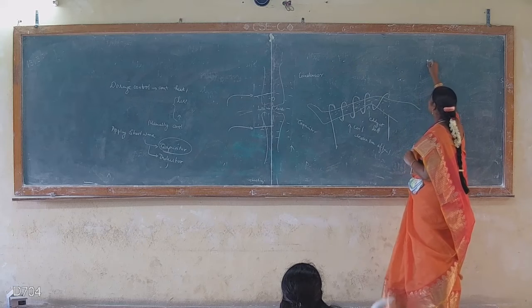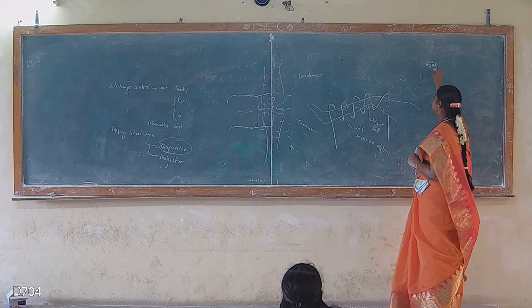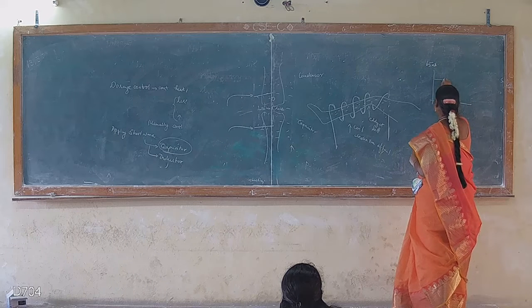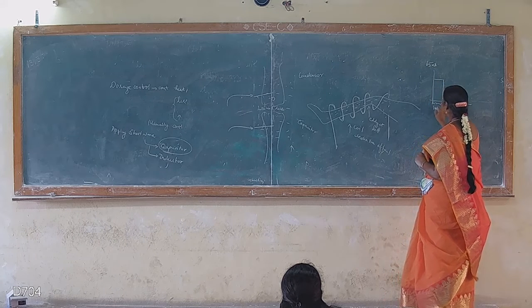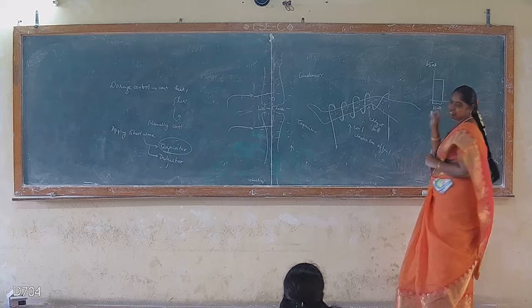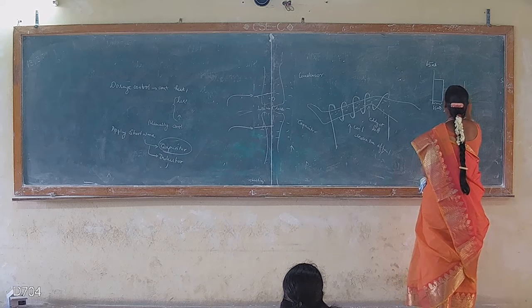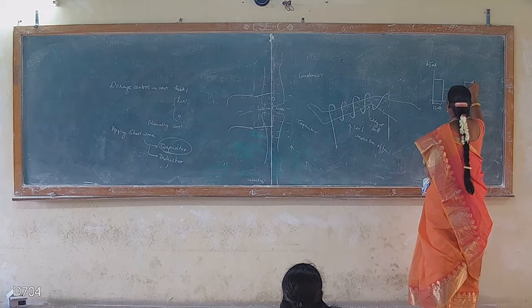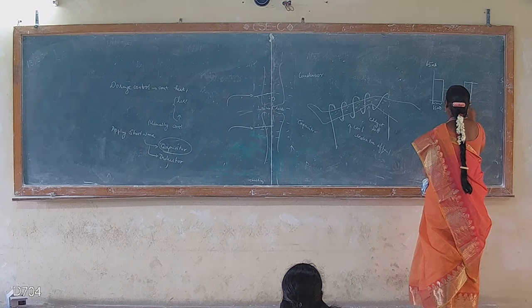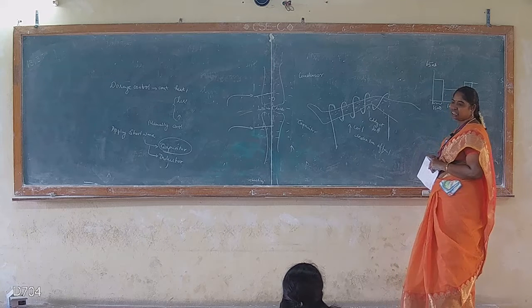Here the high frequency current we provide for only 65 milliseconds, and then the gap is 1600 milliseconds, and then the next 65 milliseconds duration of exposure of a high frequency current.